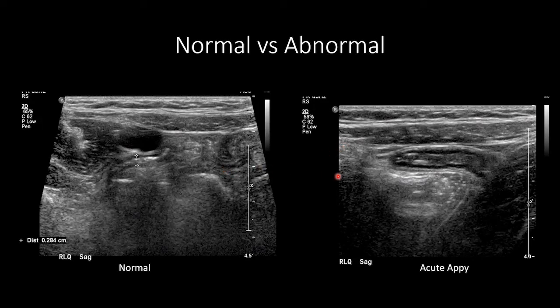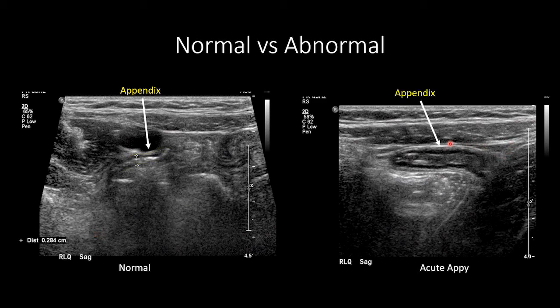Here are two more cases — one normal appendix and one acute appendicitis. The normal appendix measures less than three millimeters, well within normal limits. On the other side, we have a dilated blind-ending tubular structure measuring over six millimeters, with echogenic fat adjacent to the appendix, consistent with acute appendicitis. Another sign I haven't shown yet is the presence of free fluid near the appendix, which can also increase your specificity for diagnosing acute appendicitis.